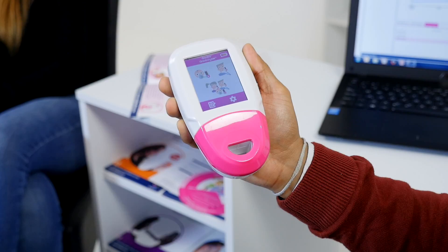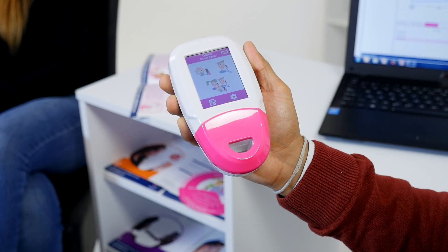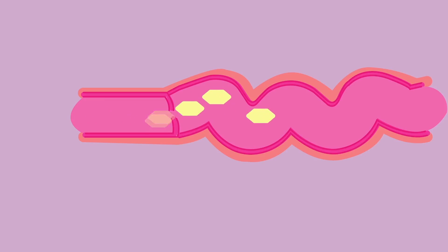The GastroPlus Gastrolyzer is a breath analysis monitor that can help find the cause of your gut discomfort. A breath test with the GastroPlus is quick, easy, and most importantly non-invasive. It works by measuring the level of hydrogen on your breath that is produced when your gut breaks down food.